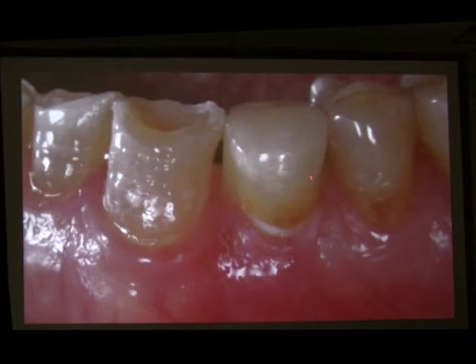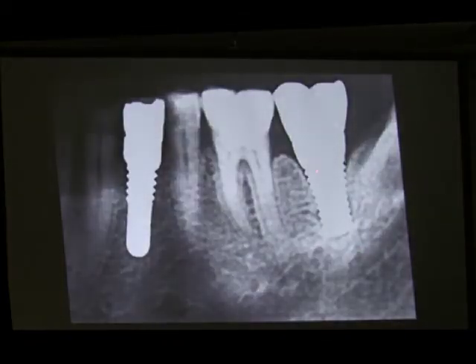And this is the finished crown. It's a full contour zirconia crown with just a little amount of chipping. And again, if he has chipping, it will look like this. So he will not even know if that is the implant or the tooth. And on the molar implant, we have full contour without even porcelain. So you can see the very thin layer of porcelain up here, and the more posterior, the more full contour we go. Yes?